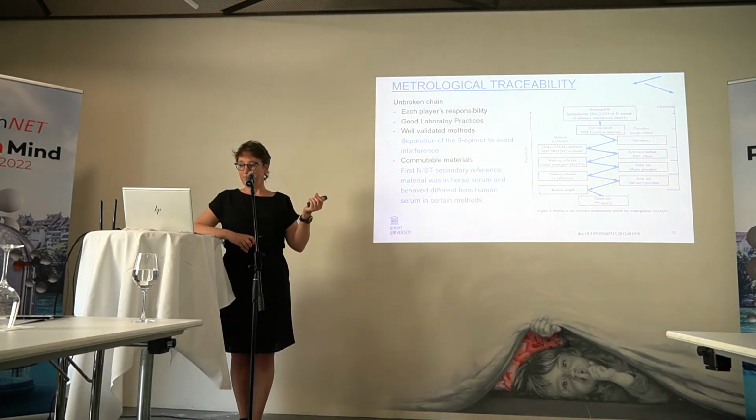So for 25-hydroxyvitamin D, we have well-validated methods which separate the 3-epimer to avoid interference. And actually, we have certified reference materials for 25-hydroxyvitamin D, and I once got a phone call from a laboratory and they said, for this material I'm 5% higher, and for this material I'm 10% higher, and for this material I'm that many percent higher. And then I asked them, do you know what you measure?